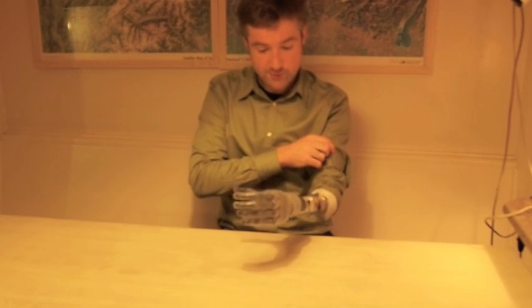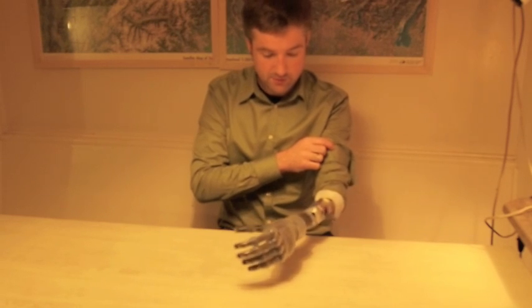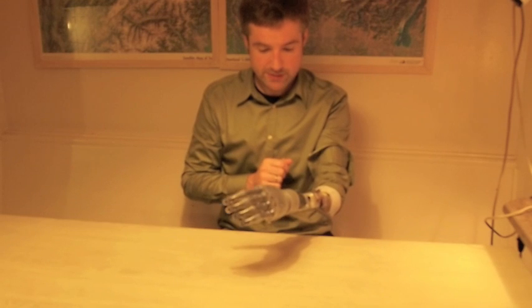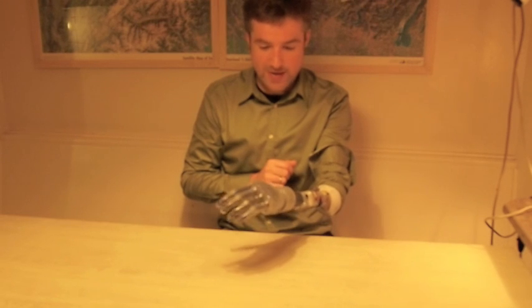But as you can see, it works. You can grab things and you can also rotate the wrist — you can rotate the wrist all the way, which is pretty cool.